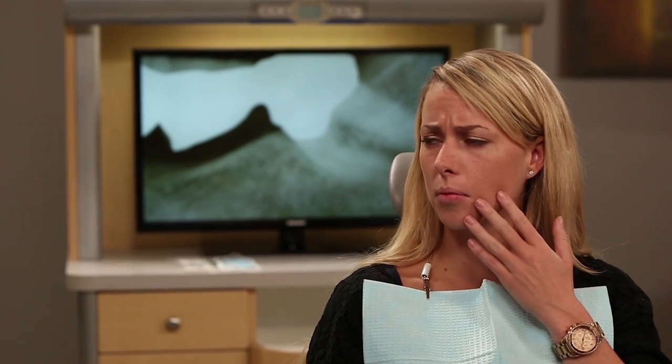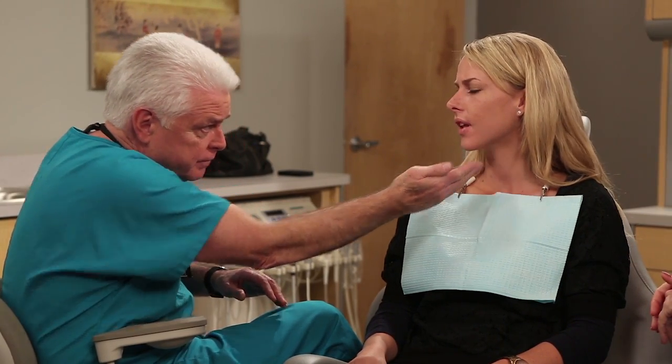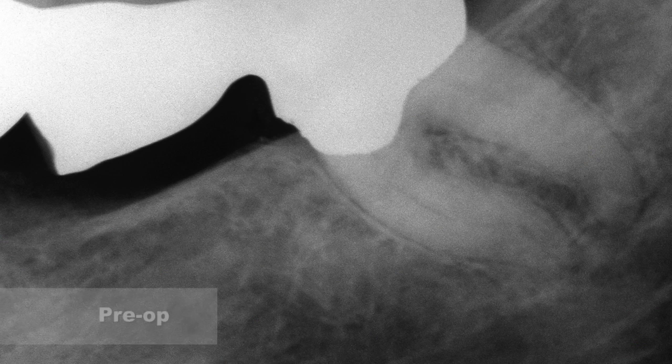This is Dr. Cliff Ruddle. I would like to show you how to use the ProTaper Next instruments clinically. As with any endodontic procedure, it all starts with an accurate diagnosis. Diagnostics is comprised of gathering the clinical findings, performing vital pulp tests, and of course, attaining 2 or more well-angulated films. When we look at this specific radiograph, notice the orientation of the prosthesis to the underlying roots. Notice that the canals appear to be long, narrow, and quite curved.